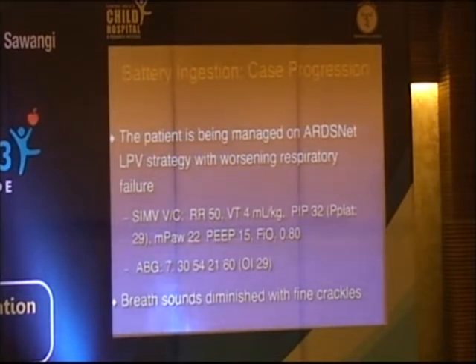The mean airway pressure was 22, and you're going to manage the patient with a mean airway pressure of 27. So if you were comparing these two strategies, this is not a fair comparison because you're giving more support with the oscillator. And in fact, and I'm not arguing against the oscillator because we have lots of experience with it, there's never been a really good study in pediatrics comparing the oscillatory ventilator with conventional mechanical ventilation using comparable settings.